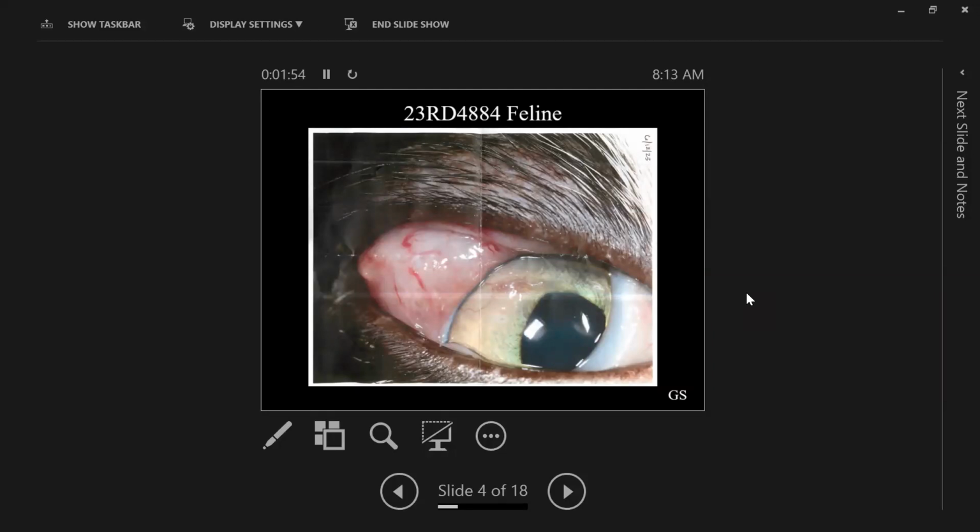But anyway, then they say in May of 2023, dorsal corneal erosions. And then, oh man, June 5th, dorsotemporal corneal ulcer. And then on the 12th, persistent firm painful conjunctivitis, chemosis. Dorsal FNA, maybe necrosis with mild neutrophilic inflammation. The cat is also FIV positive.